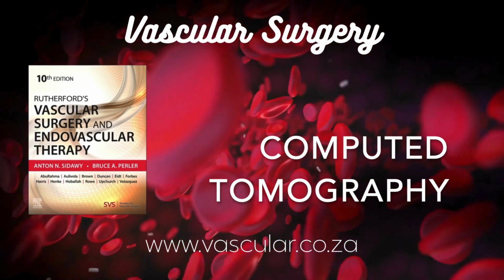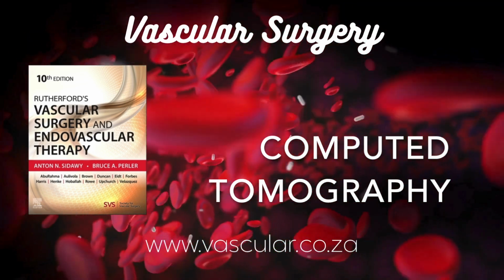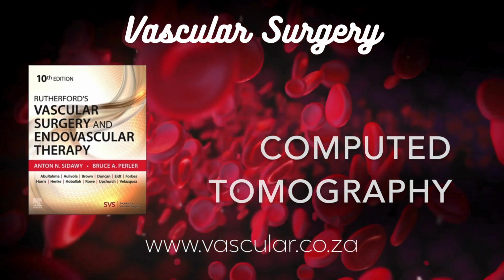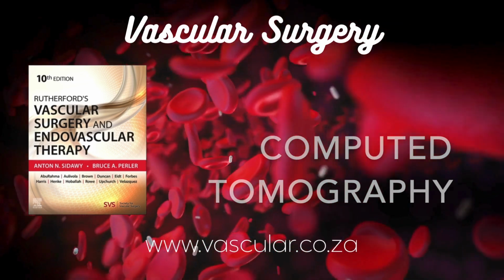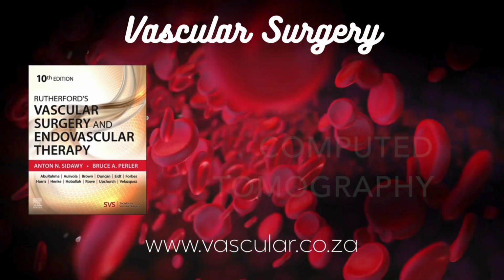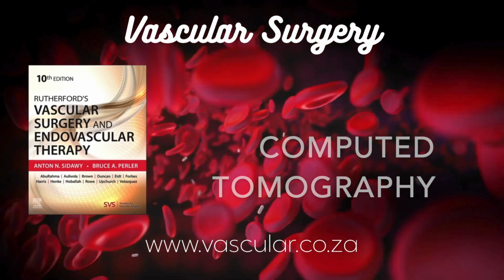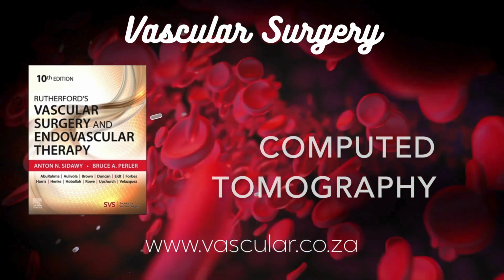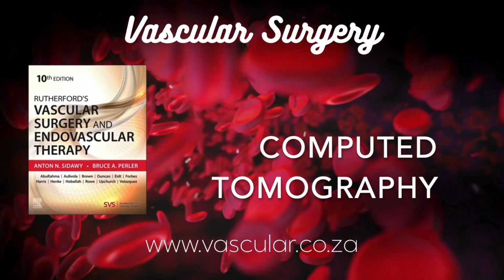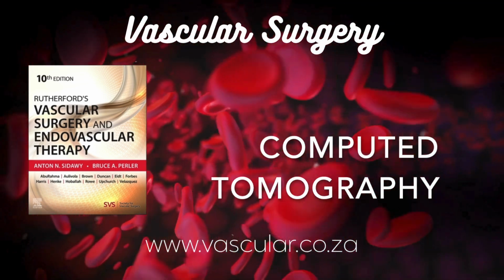Anything else? There are more advanced techniques like multiple object SSD or volume rendering, VR. VR is more sophisticated than SSD. It tries to show depth and transparency. Multiple object displays can assign different colors or transparencies based on density. Like showing bone, contrast, and maybe soft plaque differently? Potentially, yes. You could show the bright contrast lumen, the even brighter calcified plaque, and maybe try to depict the lower density non-calcified plaque or thrombus, though CT alone isn't great at telling those two apart based purely on density. Gives a more complete picture than just seeing the contrast.